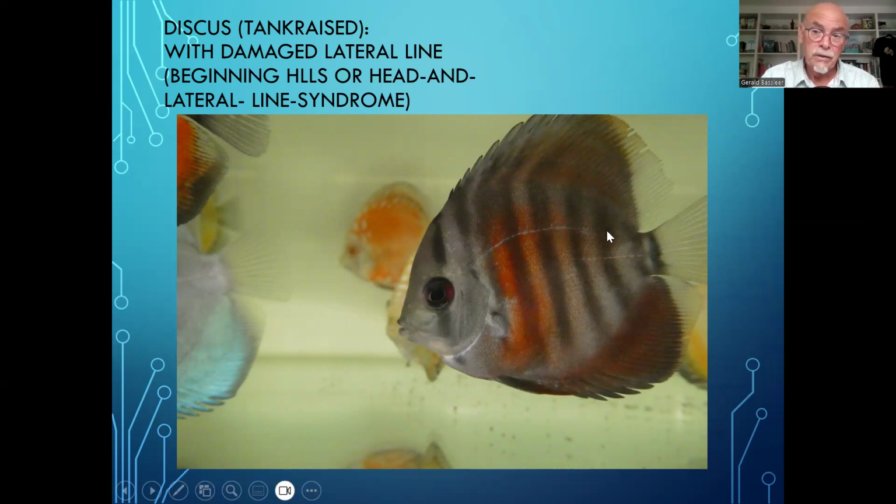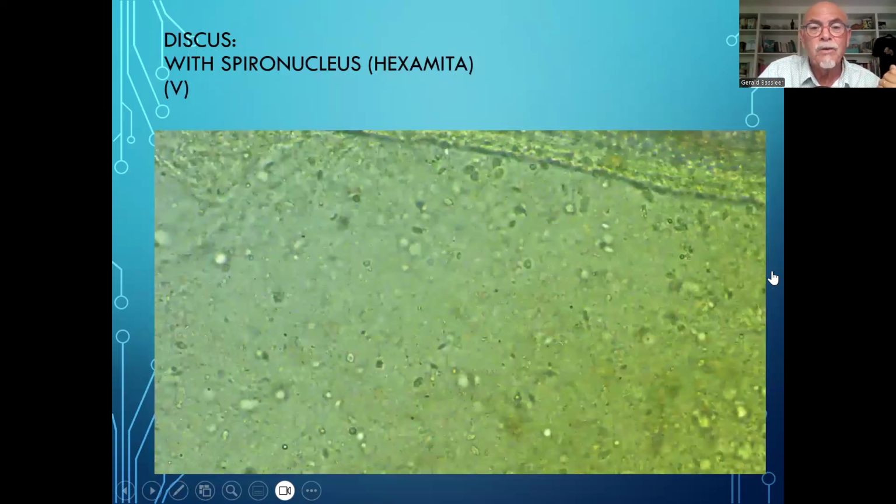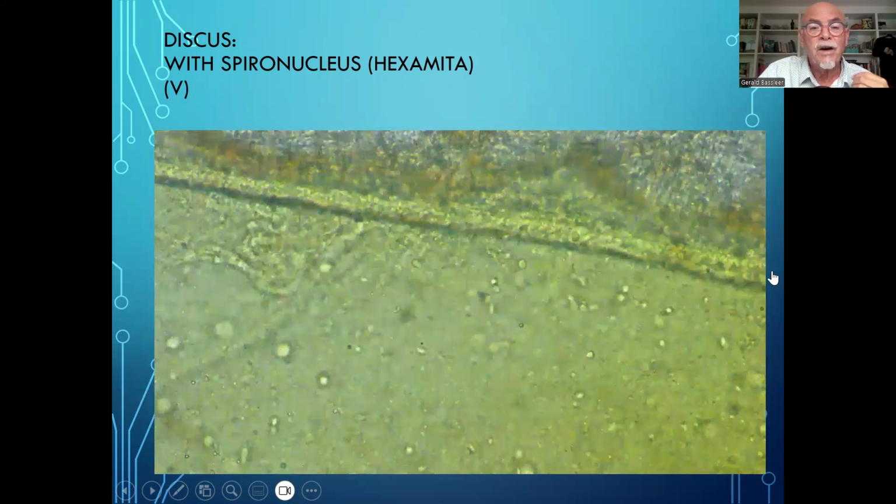And that's the thing you must learn to observe as soon as possible. When you see that, take time for examination. Particularly take time to start checking the excrements. In this case, because there was a big load of discus fish to be examined, and this group of fish were all suffering, I had to sacrifice one and then check the intestine, the gut, and look at the parasites we found.